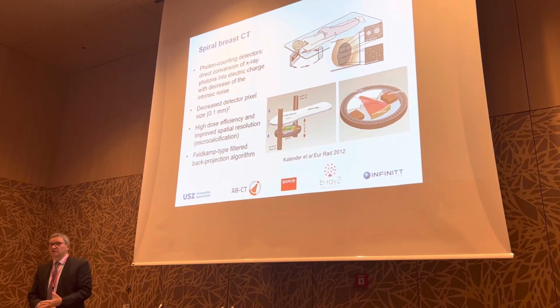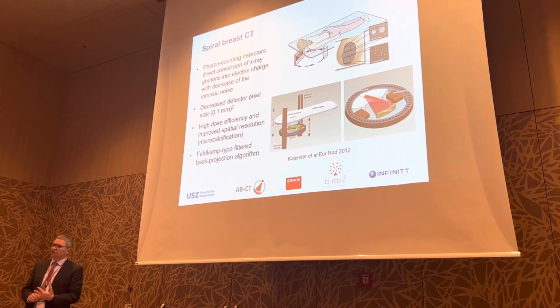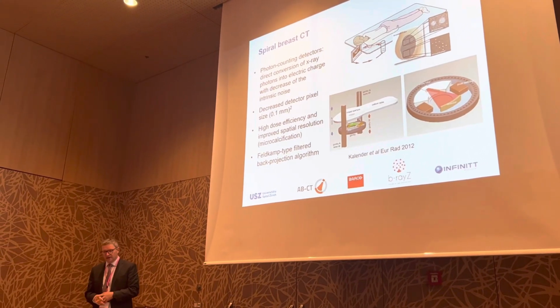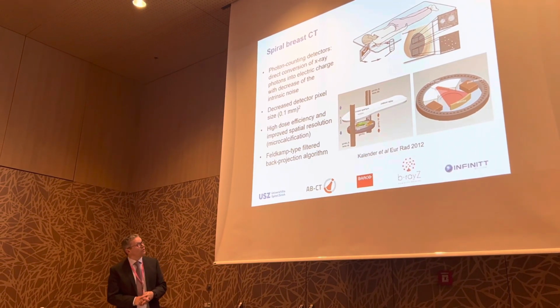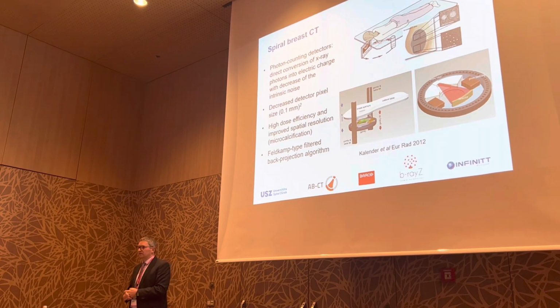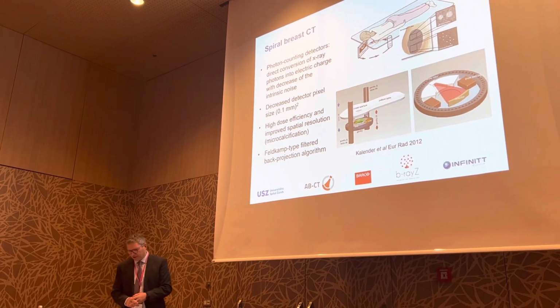And this detector is a photon counting detector, so it's the newest technology of detecting X-rays with a very, very high efficiency. Also, it has a very small detector pixel size, which is important for the detection of microcalcifications.